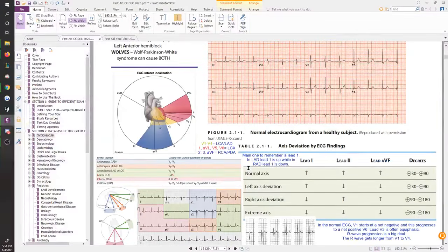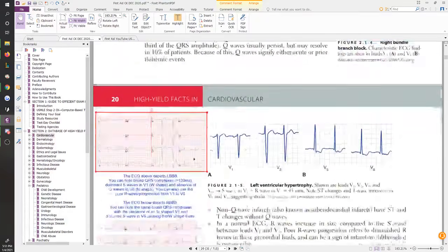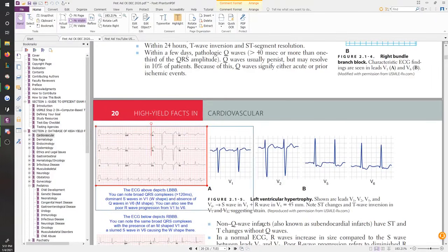Because if you look at where the leads are placed, V1 through V3 look at the right heart, right? So if a person has a left bundle branch block, their left heart is not working too well, then the right heart is going to overshoot. It's going to be, on an ECG at least, much stronger looking. And that further helps you confirm that this is probably left bundle branch block.